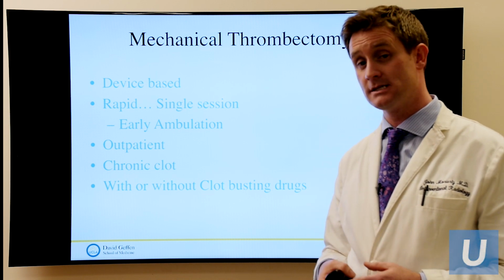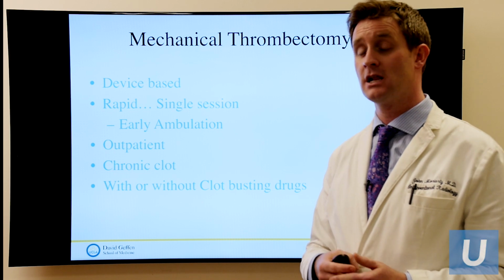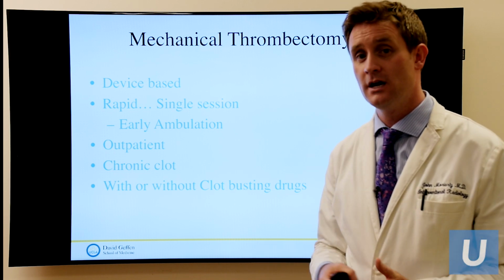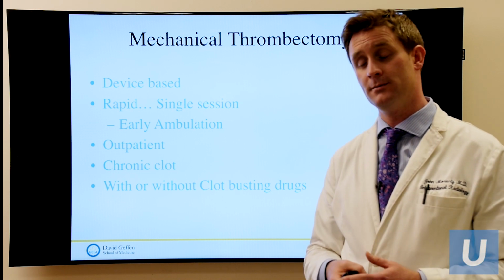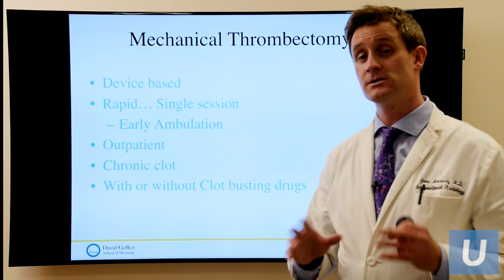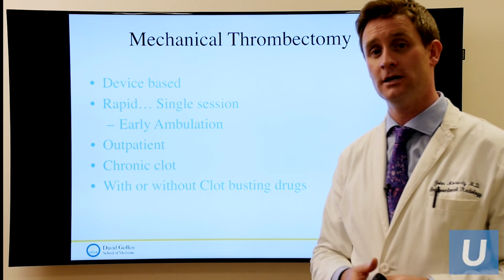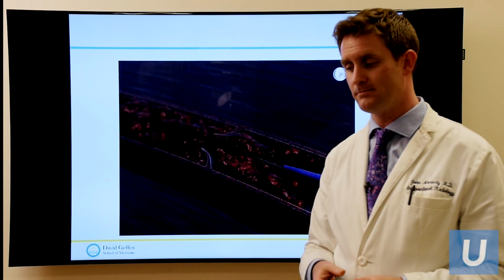There are some benefits versus that clot-busting agent when people have clot for many months or many years. Sometimes it's not amenable to clot busting, but rather we're able to use these mechanical agents to break it up or suck it out. And sometimes we use a combination of the two, again, tailored to what the patient in particular needs and what we feel is appropriate for them.